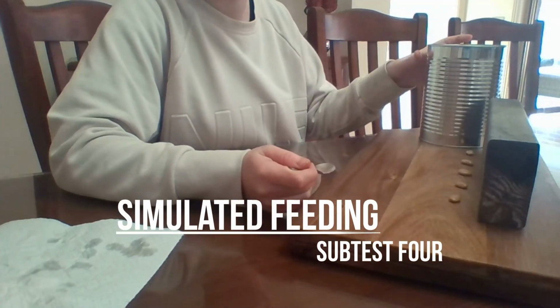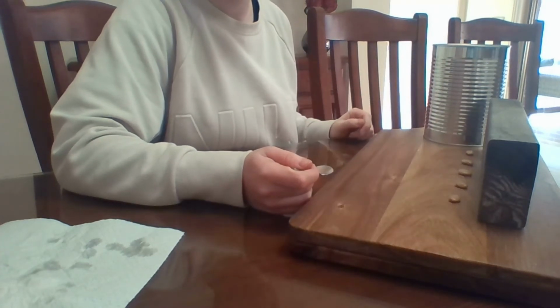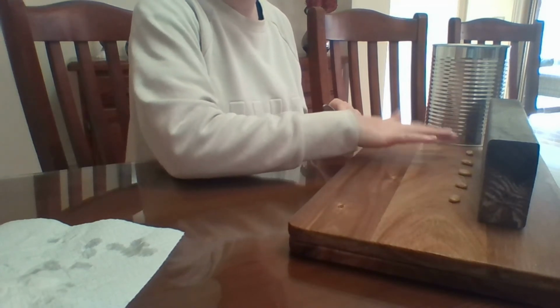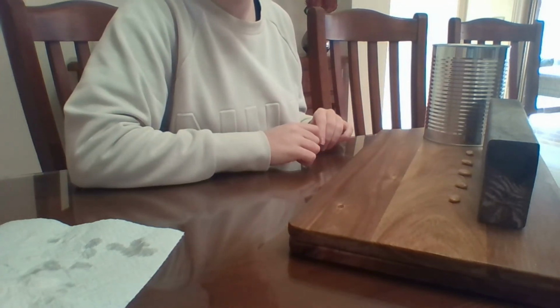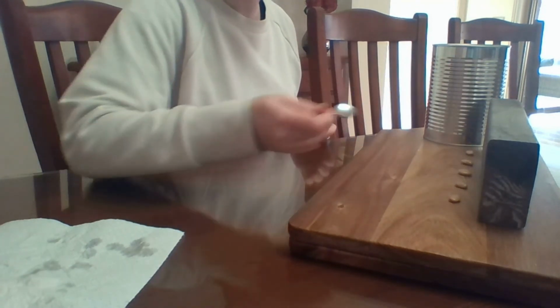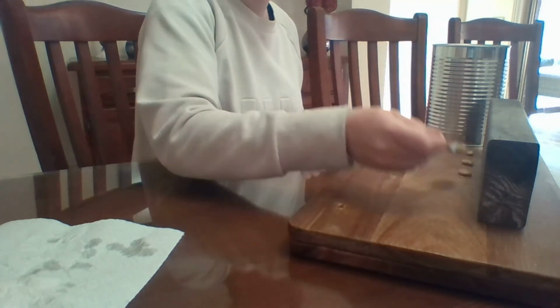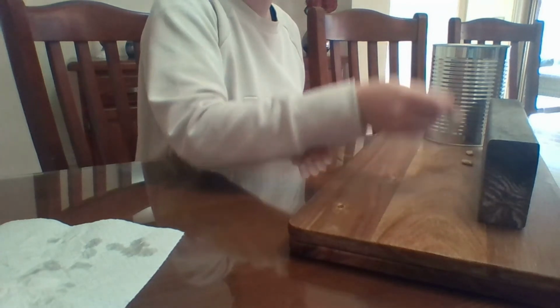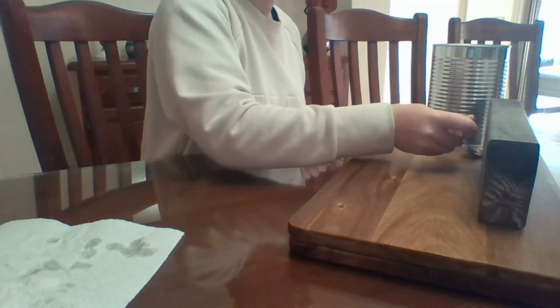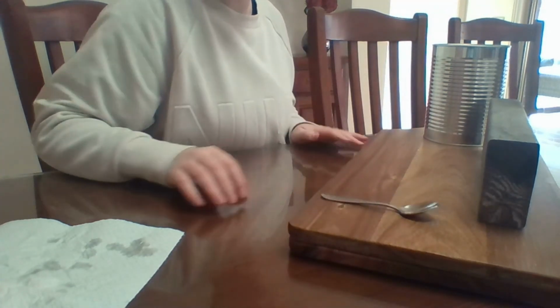Place a large coffee can on a board that is clamped to the table. Next to the can, place 5 kidney beans in a row on the side of the non-dominant hand. The placement of the cans and the row of the beans should be against the upright of the board. This is so that when prompted, the participant can use the back of the board to pick up each kidney bean with a teaspoon, starting from the outside bean. The assessor will time the participant to see how fast they can complete the task. This is then completed with the opposite setup on the dominant side.